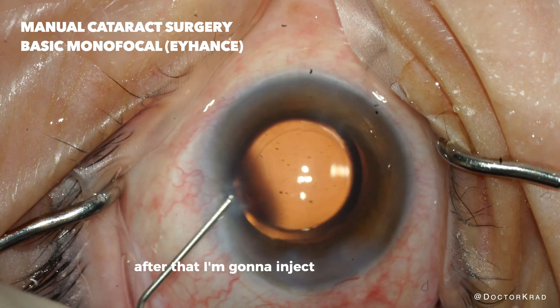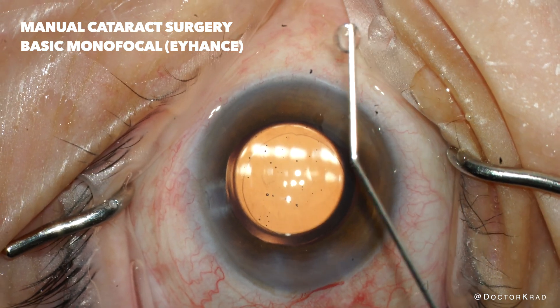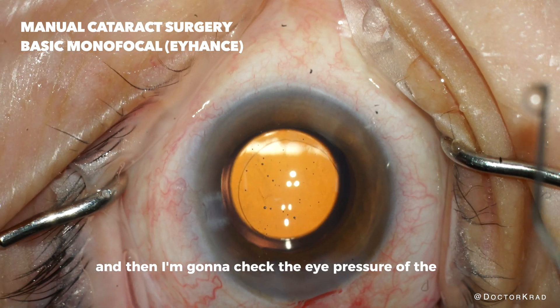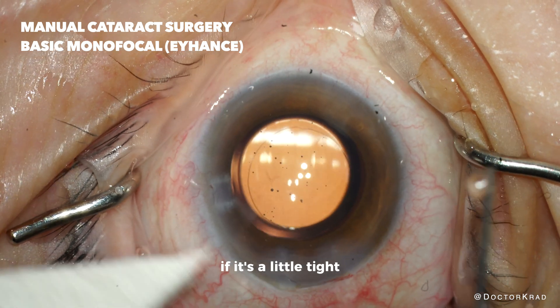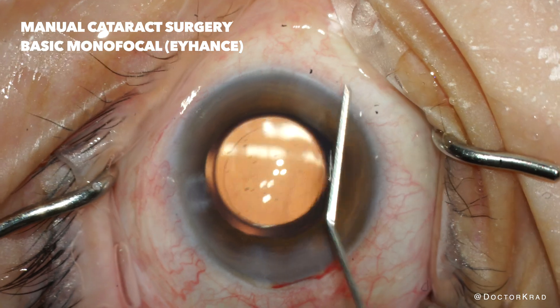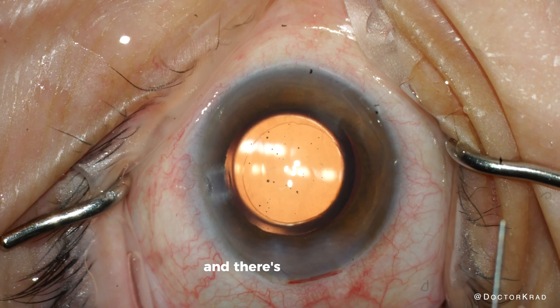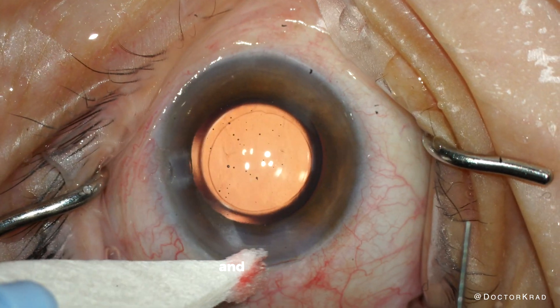After that I'm going to inject some antibiotic into the eye, just a little bit. Then I'm going to check the eye pressure of the eye. If it's a little tight I will release some fluid from one of the incisions. And I'm making sure it's watertight and there's no leaking. And that's perfect.